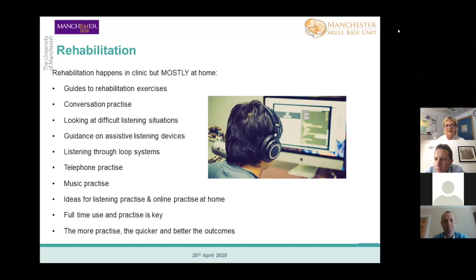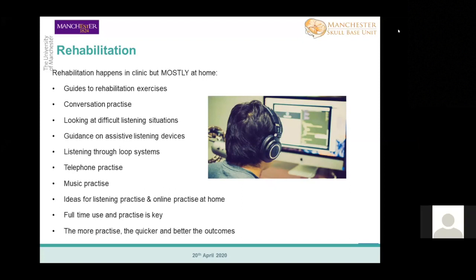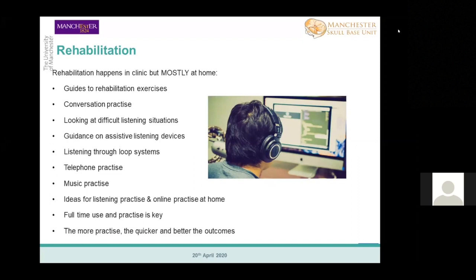There's lots of online resources now, so people can do the training at home on their computers and on their devices. Some of these speech processors connect directly to technologies, so people can listen to music and practice listening to audio books connected to the speech processor. So that's all good stuff that we do these days. And we guide people about use of other technologies that can help with their implant system.